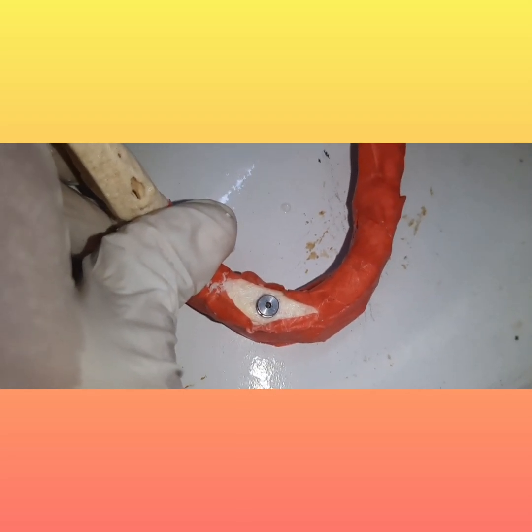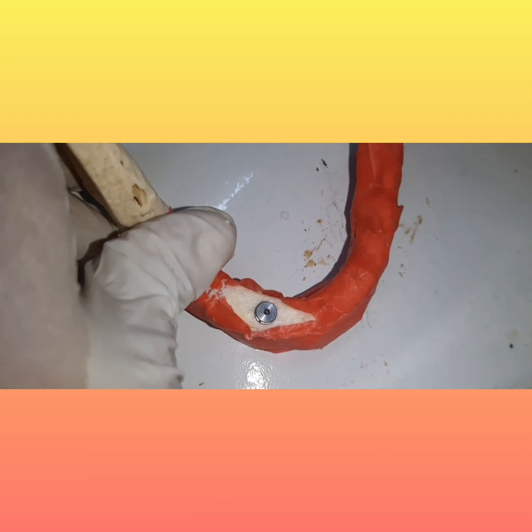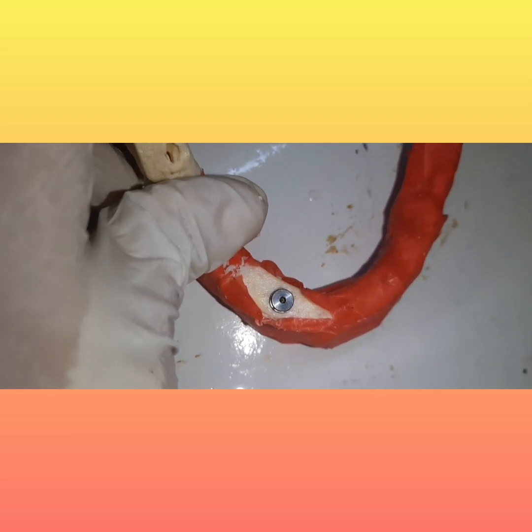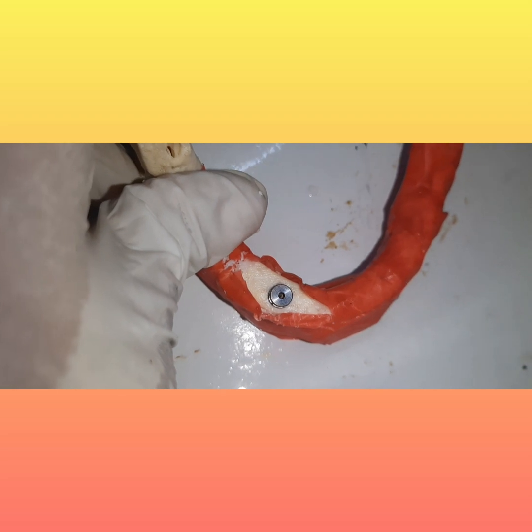You have to use a controlled torque, and you have to use obviously copious irrigation using saline, the normal saline which you use. Next is you avoid contamination of the implant surface, so never touch the surface of the implant because that may result in failure of the implant. So all these are ways in which we can improve the success of a treatment.